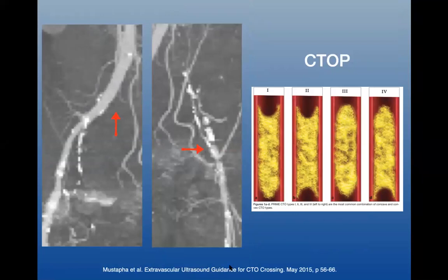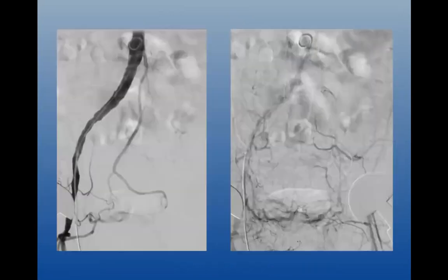So now looking at this, you can say to yourself, and I talked about this a little bit, always assess your caps. Here's the cap on my distal cap, and then here's my proximal cap somewhere around there, which I can't tell. Just based on cap morphology, I knew that this one has more of a favorable shape like this, that if I'm coming from this side, at least I'll start intraluminal at the beginning, and then that'll give me hopefully my best chance to cross.